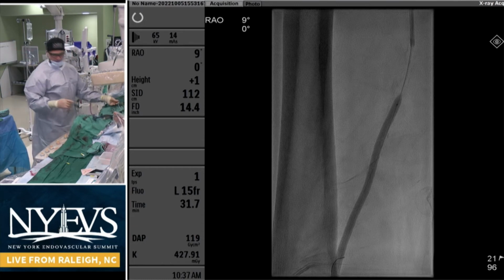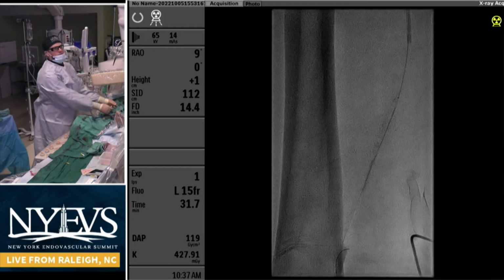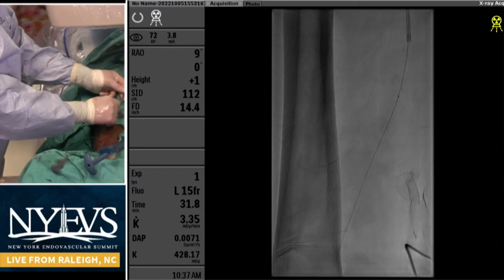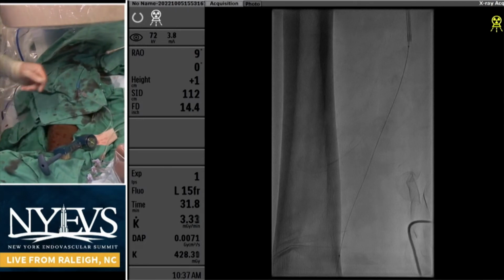Right. Yeah. So that's where we are now. Beautiful. So from the balloon perspective, what size balloons did you use to cart it? Like, we just want to know how aggressive or not that aggressive you were. Used a 4.0 or a 5.0 balloon?